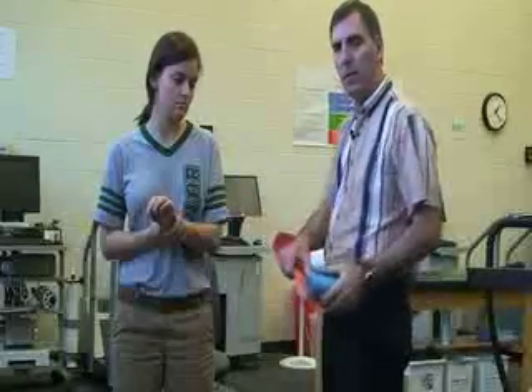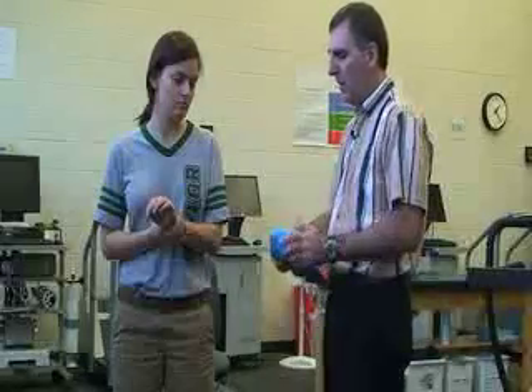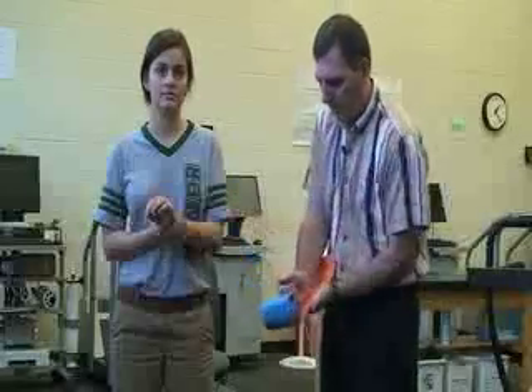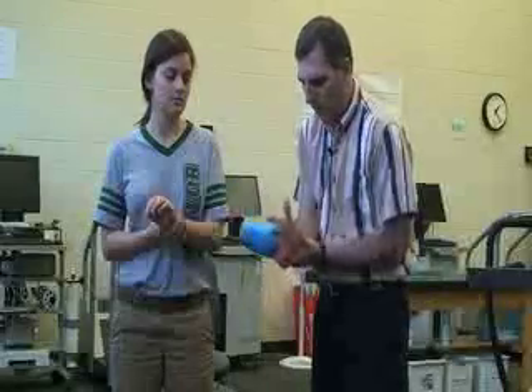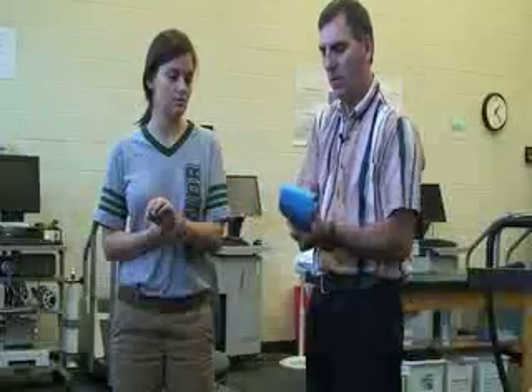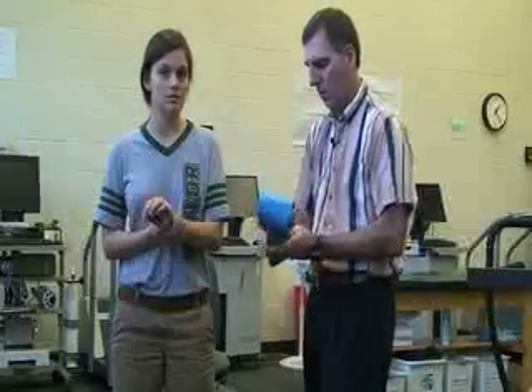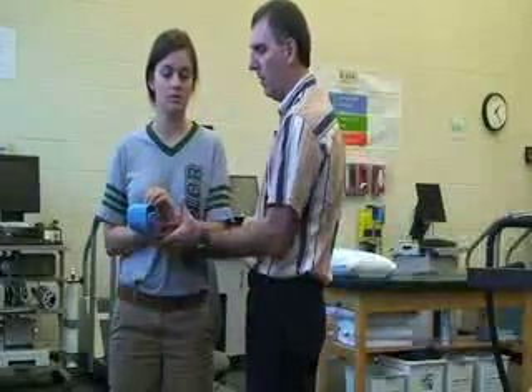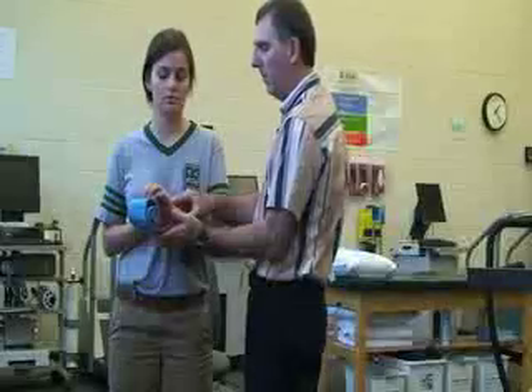One of the splints I'm going to use today is a SAM splint. It's an aluminum splint. For this one, I would measure the length of the injured spot, and before I put it on Katie, I would mold the center of it with my arm since there's no fracture. I would test this on it — one thing I want to tell Katie is try not to move it much.